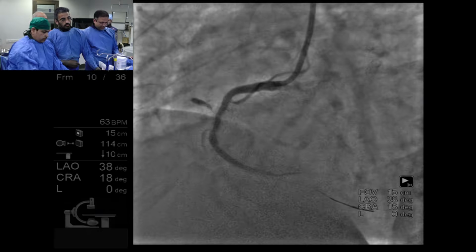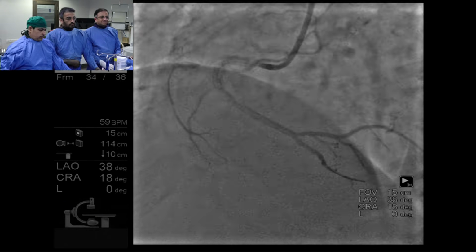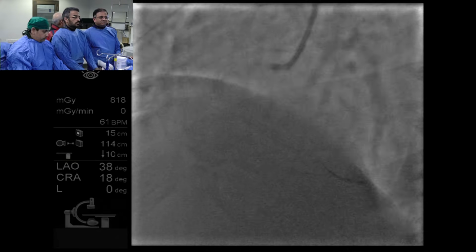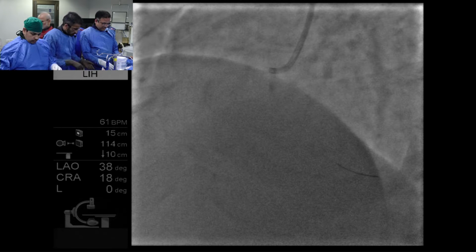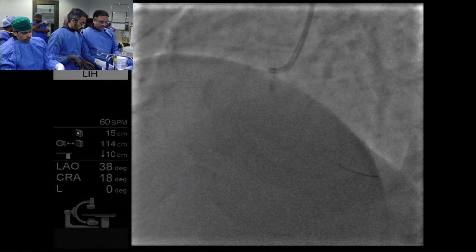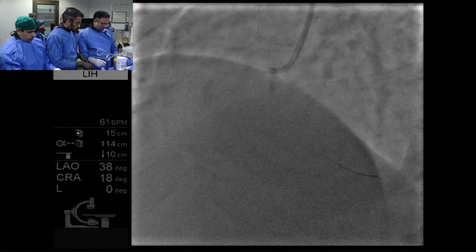Samir, I have a suggestion. Yes. You take one run of OCT and one run of IVUS and then explain how the stent failure looks with OCT and IVUS. Wonderful, no problem, with both. We will do that. So, what do you think the OCT findings for this in-stent restenosis?